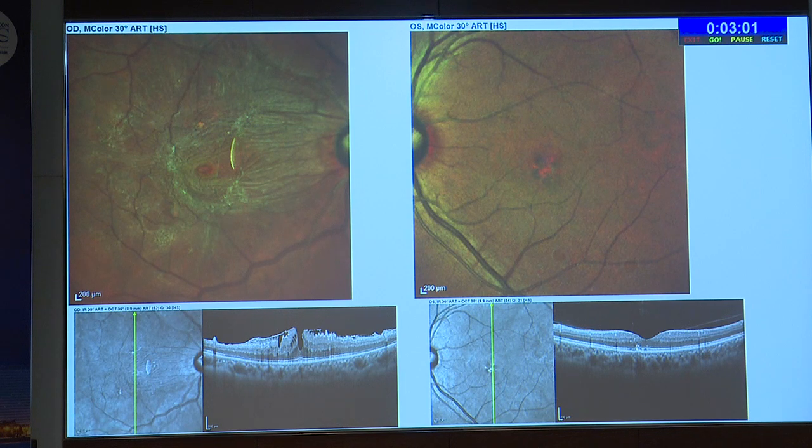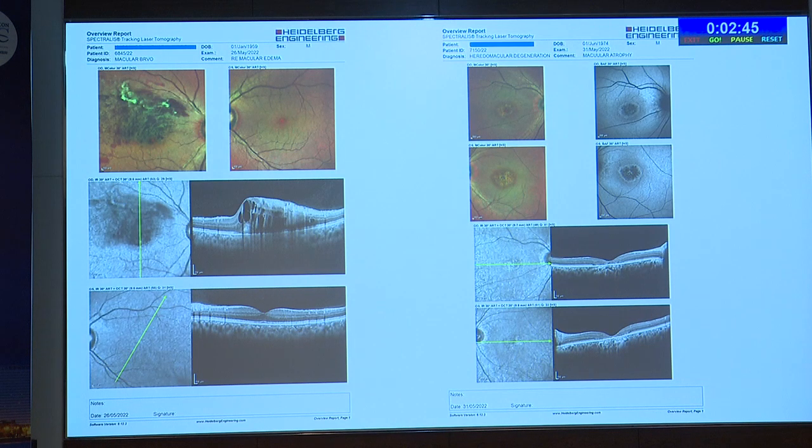So very small pathologies are missed by the ultra-wide field imaging. The true advantage of ultra-wide field imaging is the periphery, but very small, minute pathologies of the macula can be missed sometimes. If the media is not clear, or the fundus photograph is not clear, you can miss images. So this is the difference.